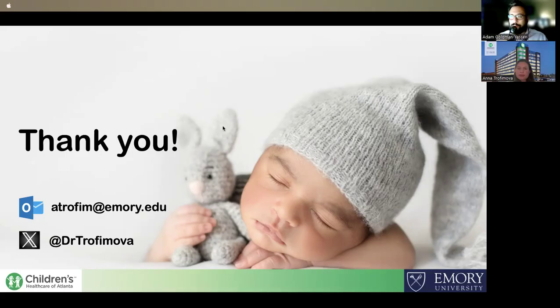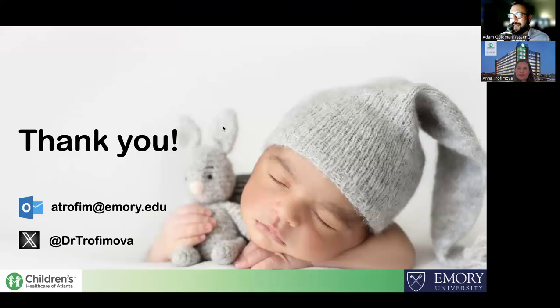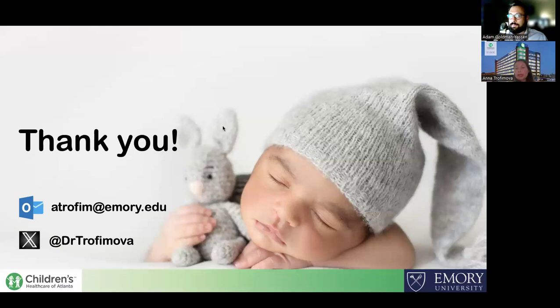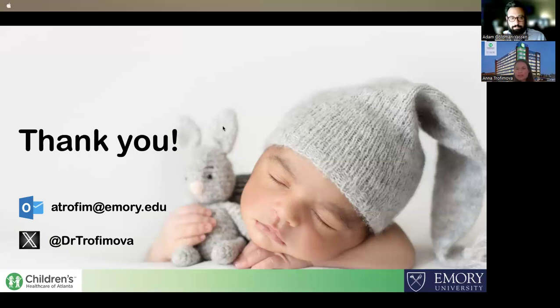Okay. Do you have time for a couple more questions? Sure, there's a couple. So one is, how commonly do you do long TE MR spectroscopy to capture the glycine peak in the setting of nonketotic hyperglycinemia? If we have a clinical concern for that, we usually perform it. So we usually do it.